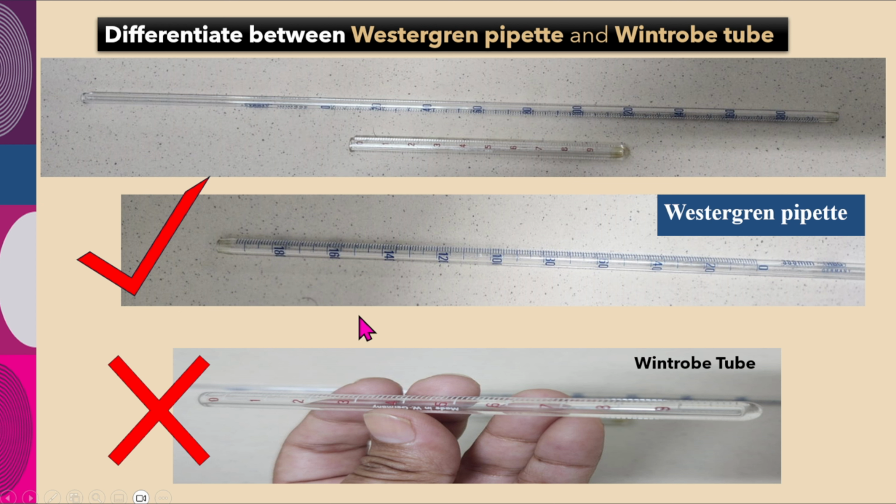First of all, we have to differentiate between two tubes. This long one is basically the Westergren pipette. A pipette is open at both ends, however, a tube is open at one end. But in many books, presentations, or websites, you will see the word Westergren tube also used.